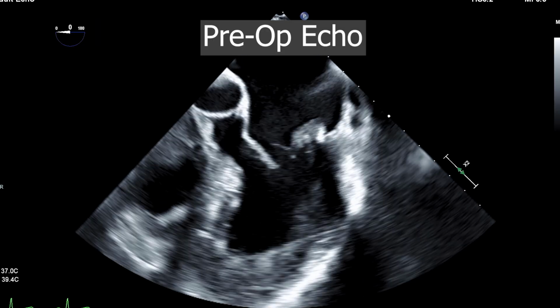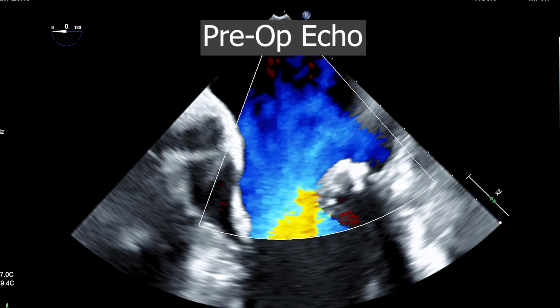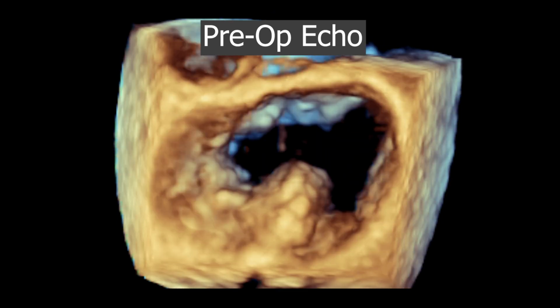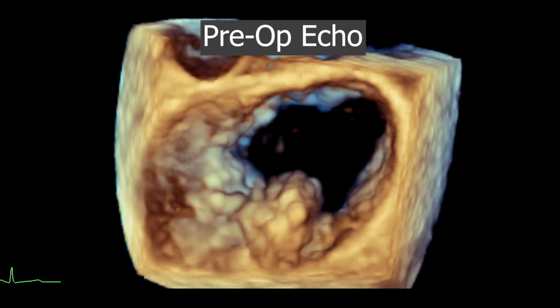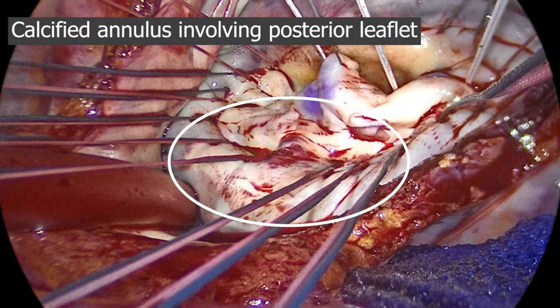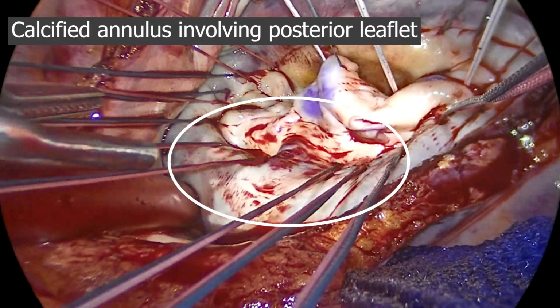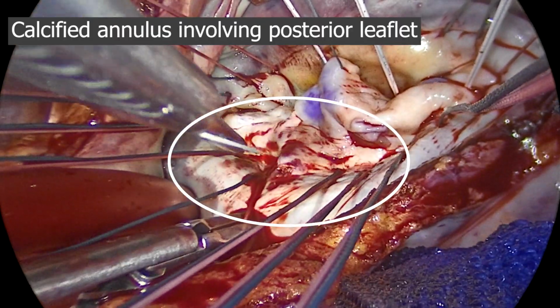His preoperative echo demonstrated posterior MAC that involves the leaflet. His 3D echo demonstrated P2 and chordal flail, as well as posterior MAC. Annular sutures have been placed for exposure, along with 3 neocords in the papillary muscles. The highlighted area reveals calcification of the posterior annulus involving the posterior leaflet. By probing the annulus, we can assess its rigidity and the extent of calcification.